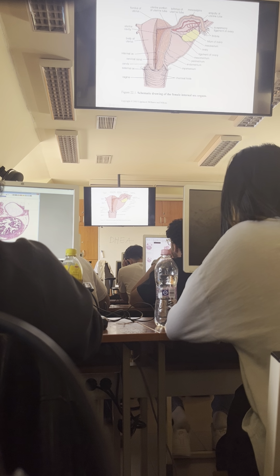And this is, in terms of, if you take the other similar term, mesovary, what we learned last occasion, this is quite similar, okay? And this is also visible in the section, the mesosalpinx.